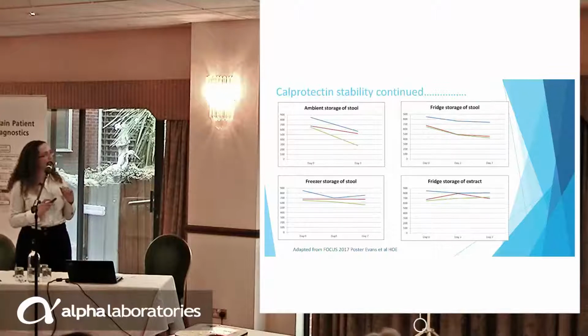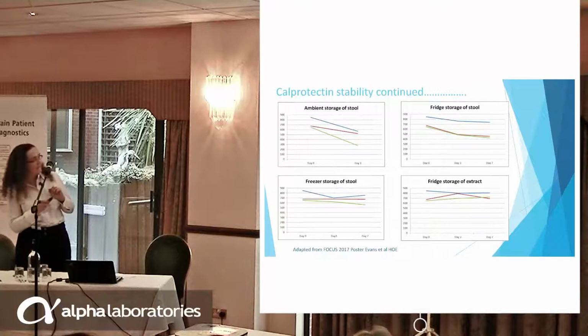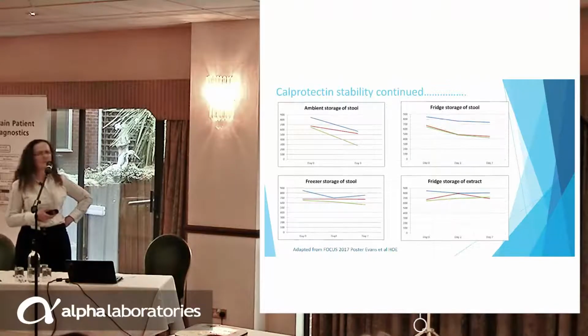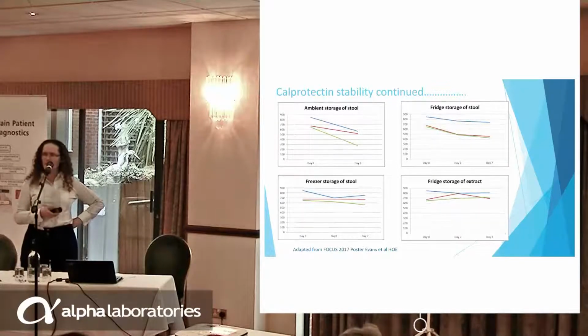They took the same samples and then put them in the fridge. And as you can see, they then tested at day 3 and day 7, and they have arrested the degradation, but there's still actually a reasonable amount of drop-off there.